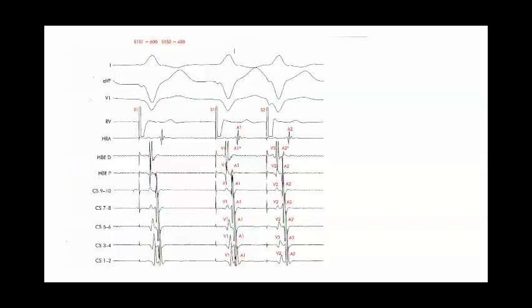So I start by pacing the ventricle, and I see this pattern. This pattern is this sharp spike. This is seen on all electrodes, on all catheters, and this shows us the spike coming from the pacing, and from the channel which is responsible for the pacing, or where I am pacing from, I see this rectangular pattern. This rectangular pattern refers to the origin of the spike, but all the rest of the catheters show this line.